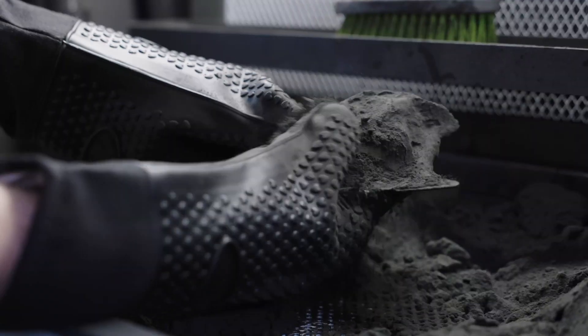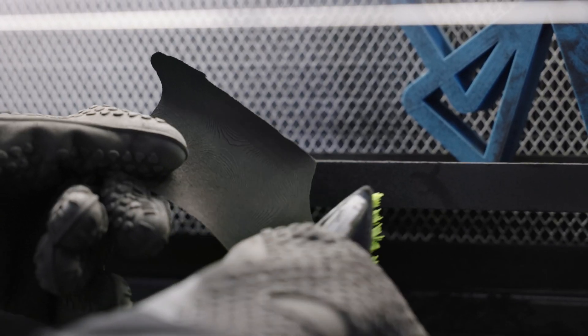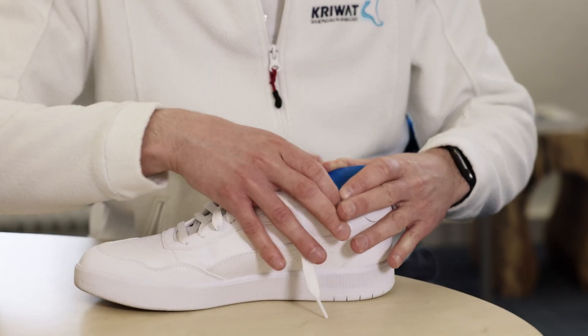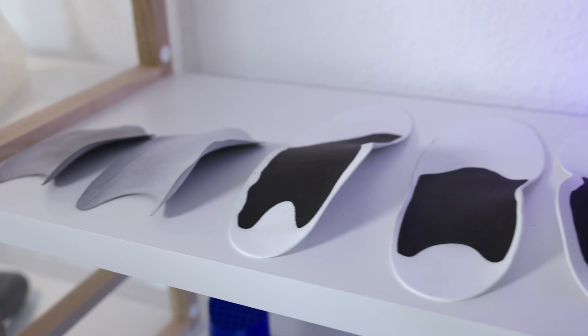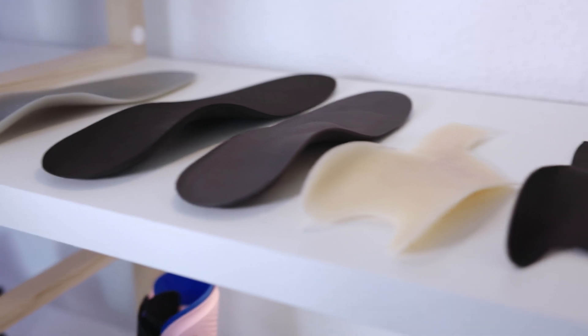That means we now have the ability to create a perfect fitting orthotic for a patient within 24 hours. This offers an extreme advantage for us because we can provide care quickly. But at the end of the day, the most important thing is the patient who has a problem and for whom we can provide the best care within the shortest possible time. On the Fuse 1, we mostly print insoles. We can print custom insole shells or even whole insoles on it, rapidly and in very high quality.